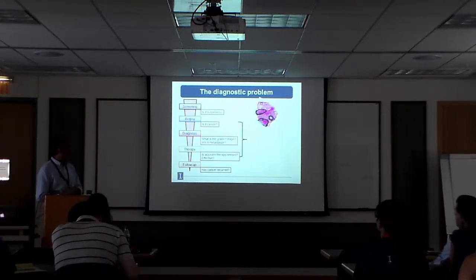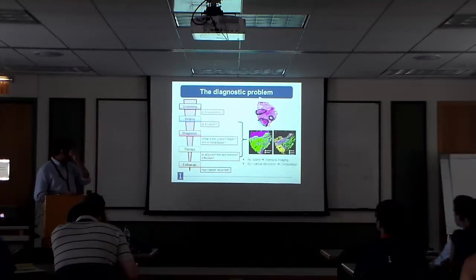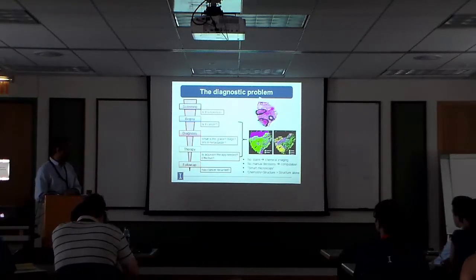And they used a sophisticated microscope and actually figured out here's cancer, here's cancer. This, for my benefit, they said is normal, right? So we're trying to do exactly the same thing in our lab, except we don't stain tissue. This is unstained tissue. This is one section of it. This particular tissue is just the next section. Okay, so it's the next cut. It's the next 5 microns section from this.